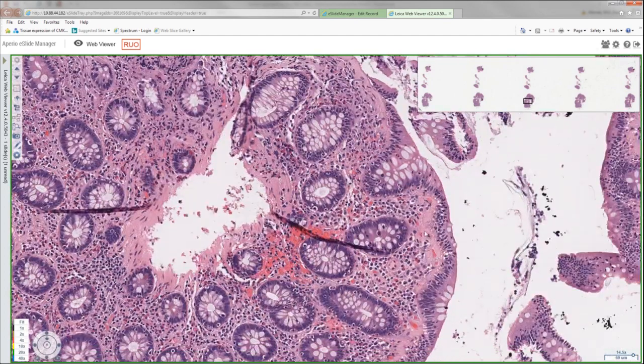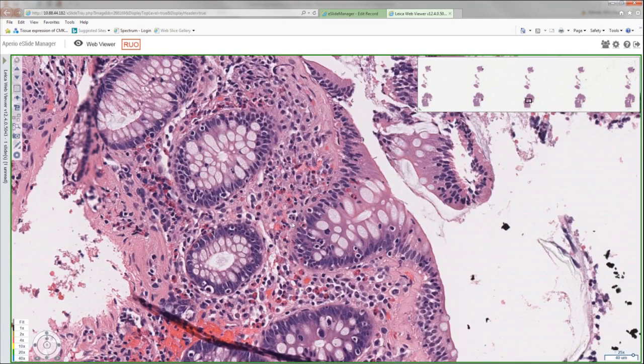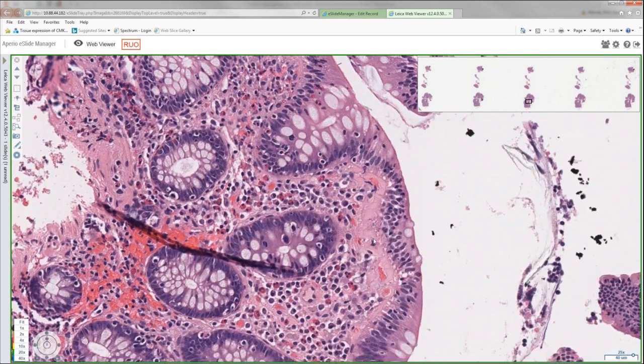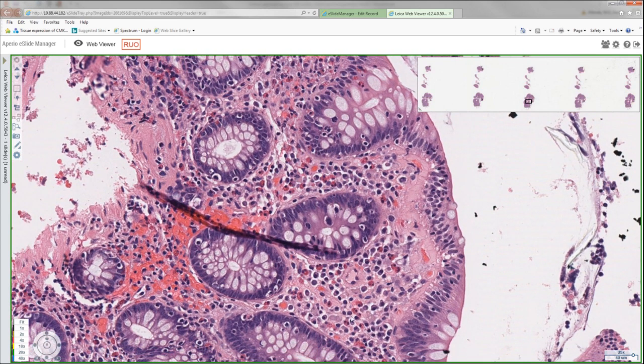If you look at the subepithelial region here, the other finding of this case is this thickening of the subepithelial collagen table. Normally, I would say it's more like this. So the inflammatory cells present in the lamina propria reach pretty much the epithelium on the surface. Here, there's a gap that is filled up with subepithelial collagen. There's entrapment of capillaries and inflammatory cells in that area as well. I want to point out that there's a very prominent eosinophilic infiltrate as well in the lamina propria in this case.